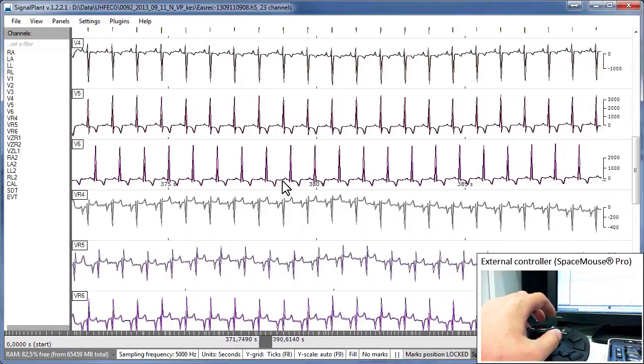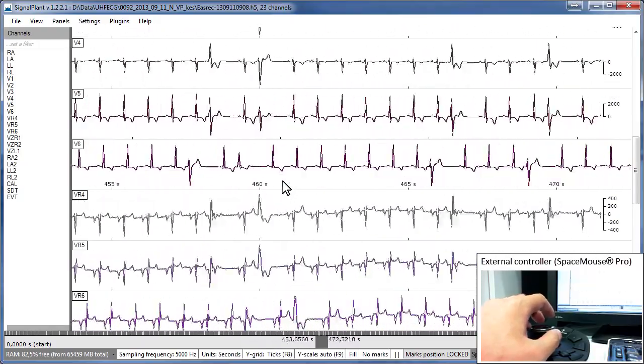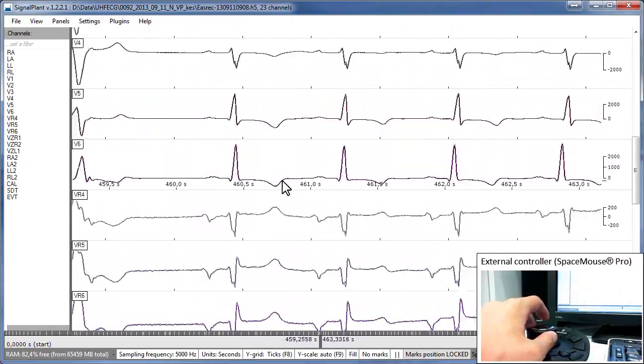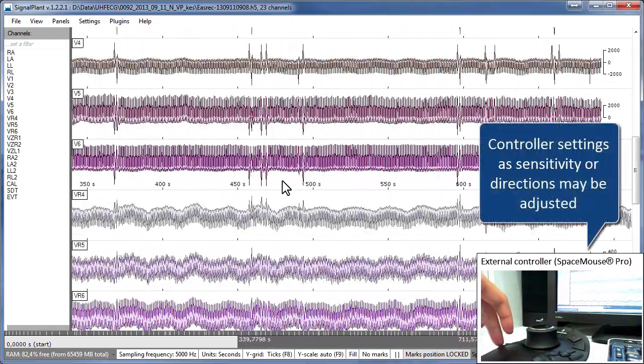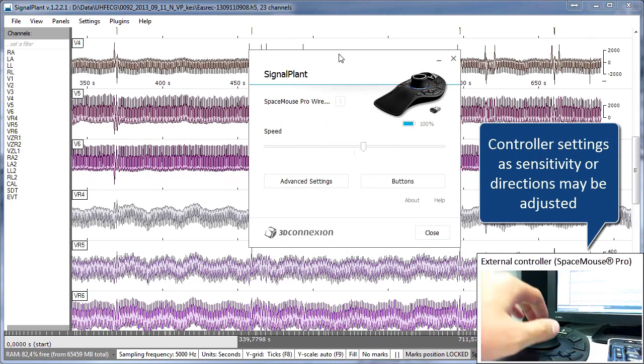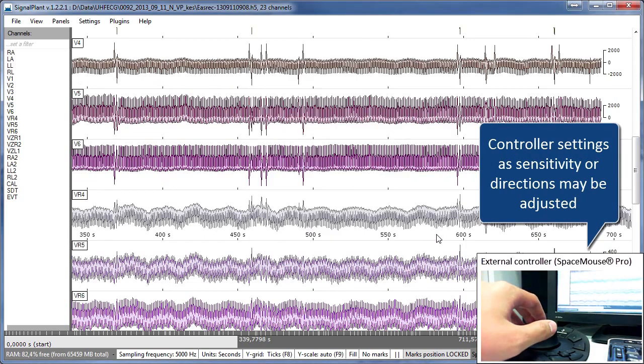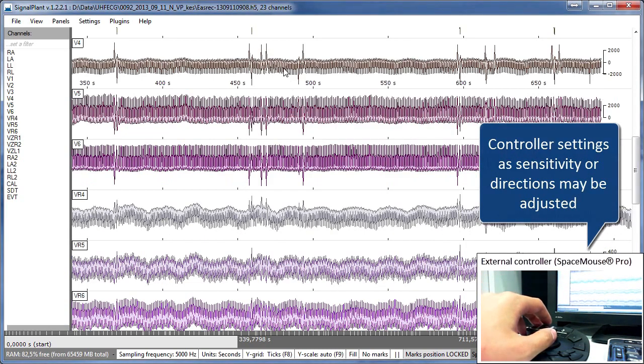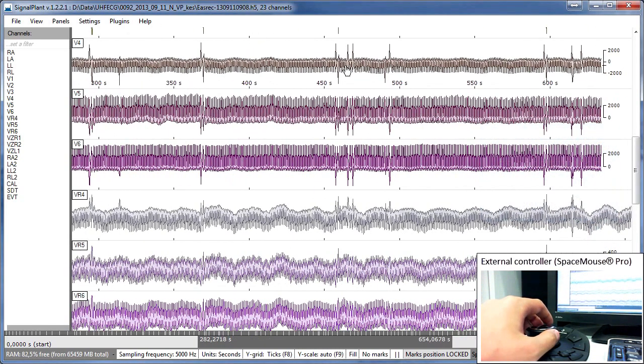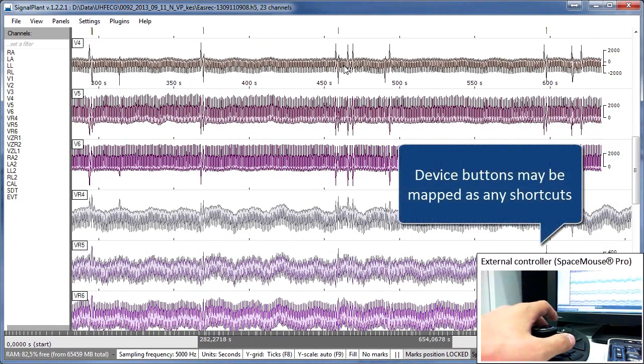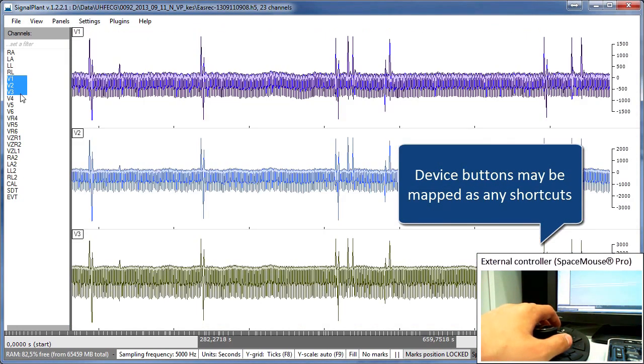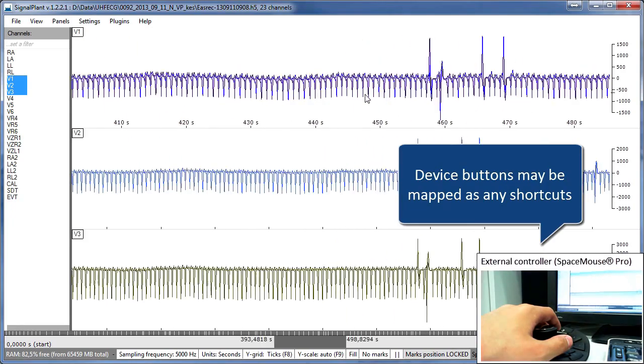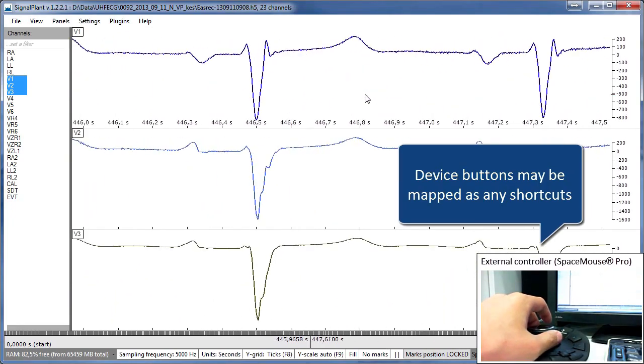Controller sensitivity and other settings may be adjusted in the device system menu. In the same menu device buttons may be linked to SignalPlant shortcuts. Therefore you can zoom to all or hide and show y-axis or run whatever favorite shortcut you have.